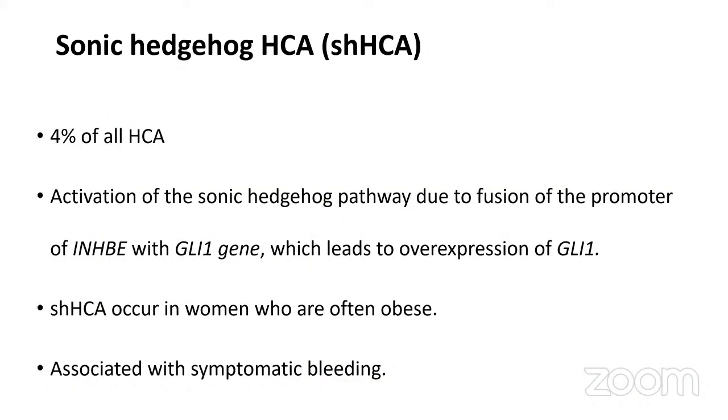The sonic hedgehog mutated adenomas. So these are 4% of all adenomas, and this is the most recent subtype, described first in 2017.